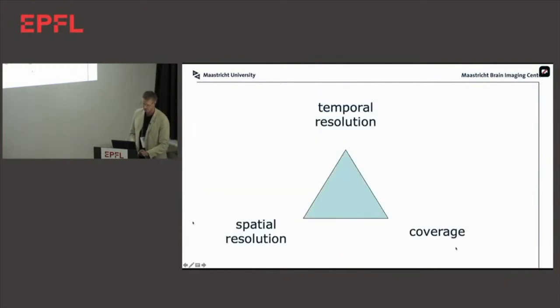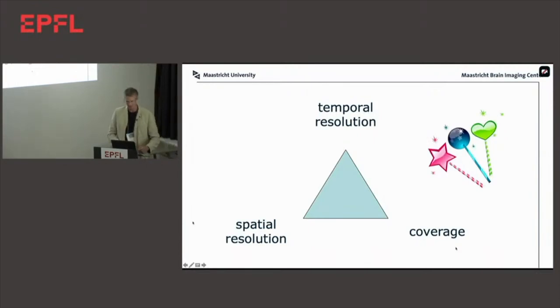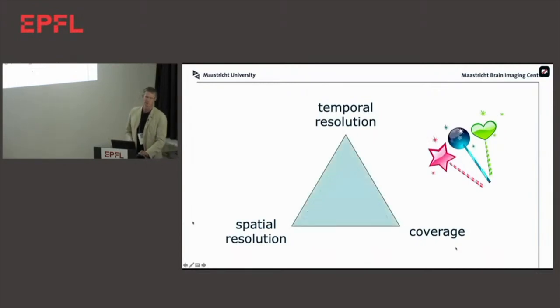But anyway, whatever your choice of method, you will basically be trapped somewhere in the triangle where you're trading off between temporal resolution, spatial resolution, coverage, and those fundamental things that hinder MR from being the really fast and easy to use method that we would love it to be. But at some point, somebody, a magic fairy, comes along and wiggles a stick, and you can grow that triangle a little bit by whatever pushing technology you can throw at it. And that's great, because then you have more flexibility. You can go in any direction in that triangle a bit more freely, and invest it the way you want.